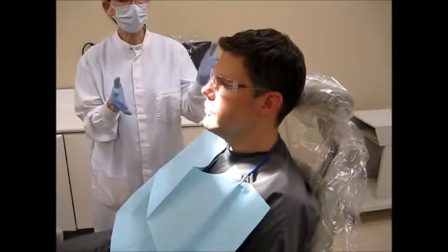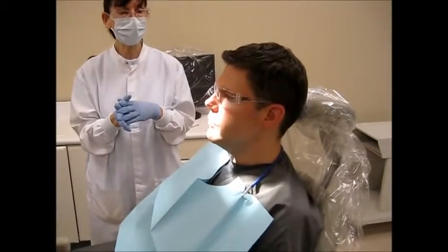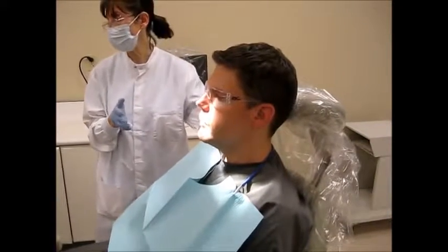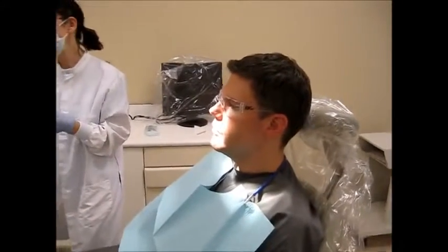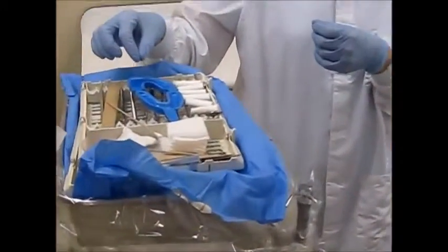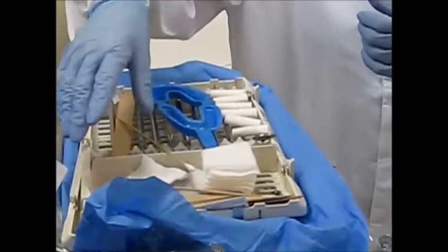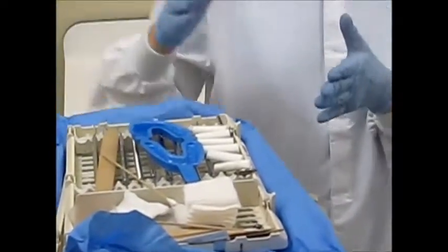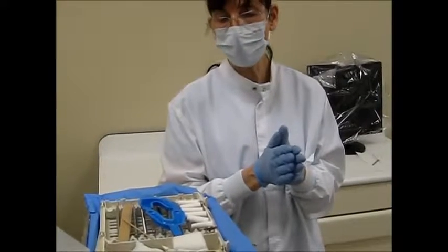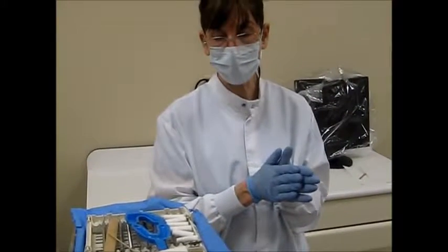So I would provide the patient with the rationale for the fluoride. I would ensure that I had all of the supplies that I needed, that they were seated in the most upright and forward position. The supplies that I would need to have obtained from Central Supply are the correct size fluoride tray, the correct fluoride. It would either be the acidulated phosphate fluoride that we have here or the neutral sodium fluoride that we have.